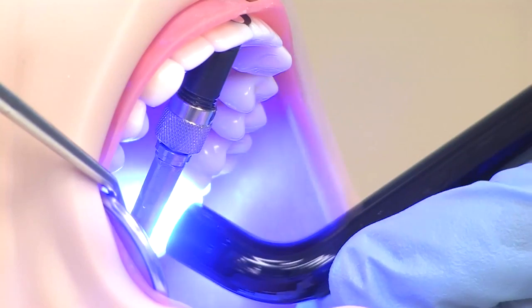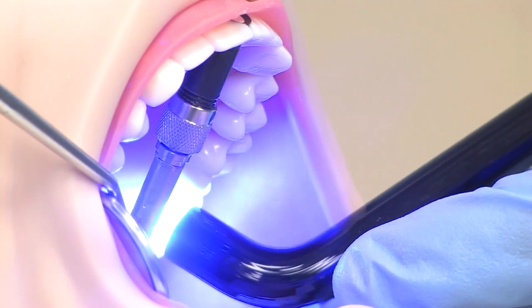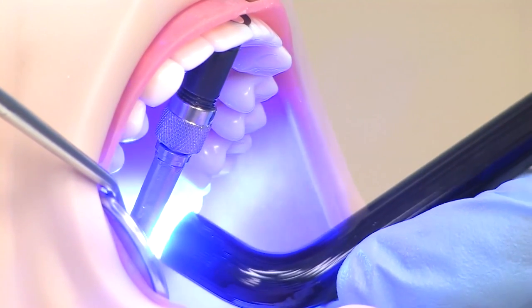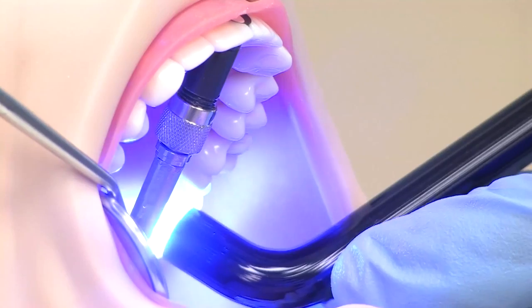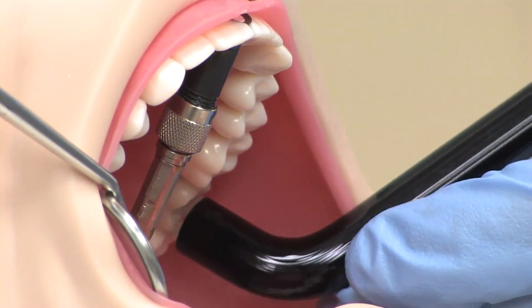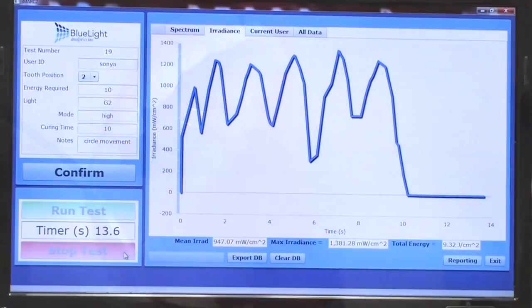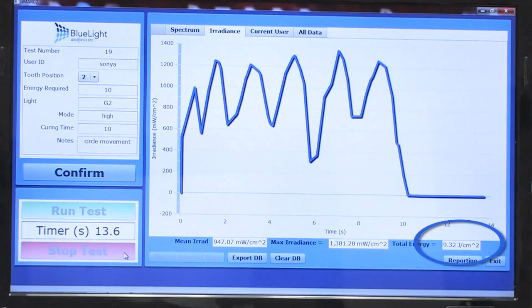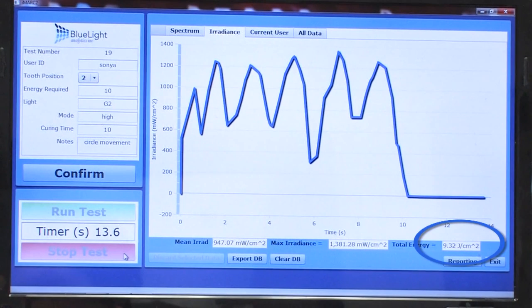Here we can see the effect of moving the light guide around while curing. Looking at the real-time display of energy, we see it delivered 9.3 joules per cm².